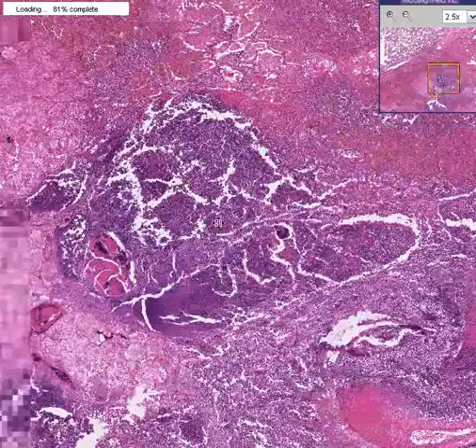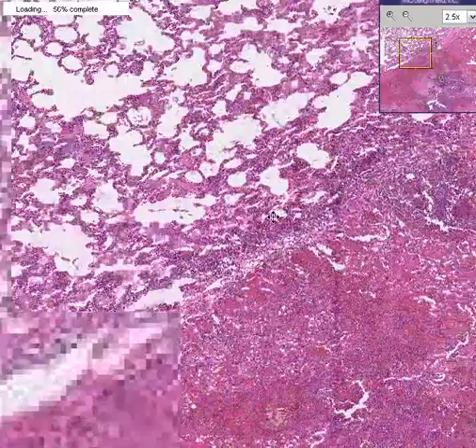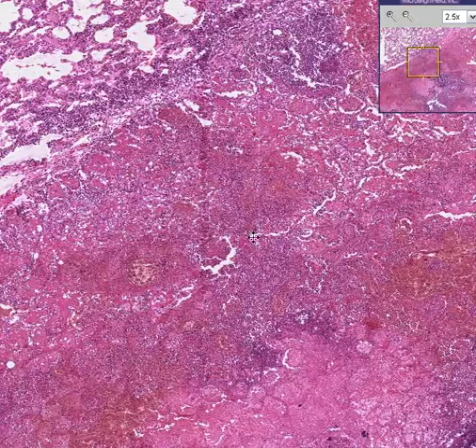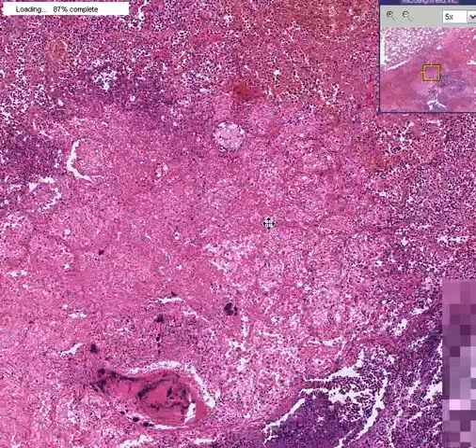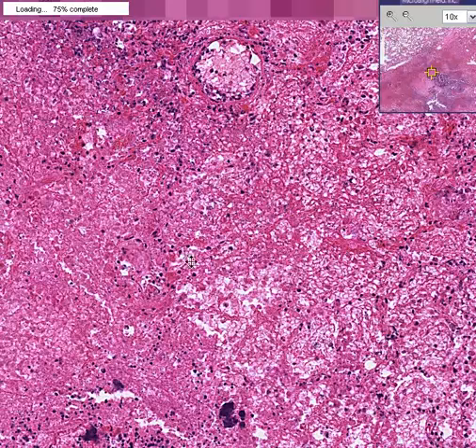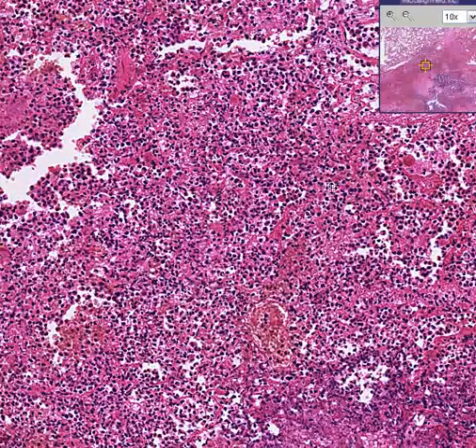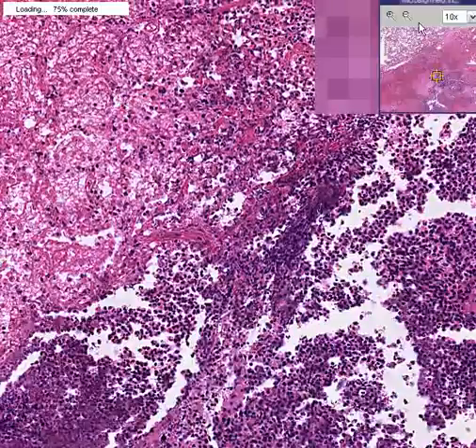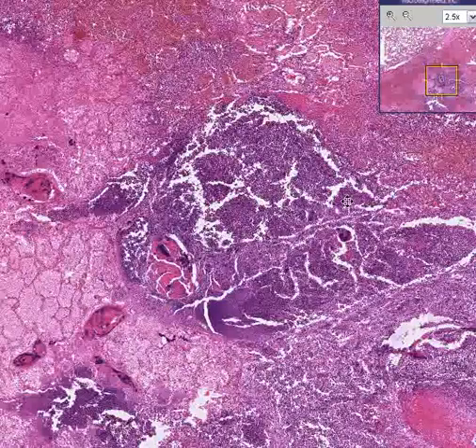An area like this clearly demonstrates alveoli that are relatively normal — perhaps a little congested but filled with air — whereas in an area like this the alveoli are infiltrated by proteinaceous material and blood cells. And in an area like this you have chiefly neutrophils infiltrating the alveoli, which is essentially pneumonia by definition, and in addition there is a fairly well-defined abscess as well.